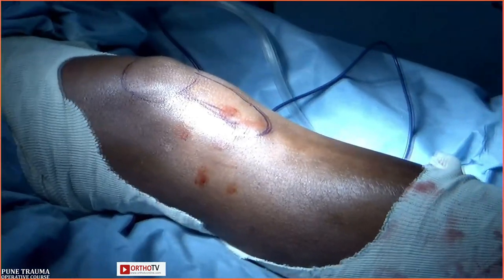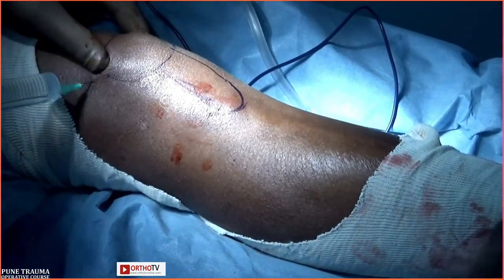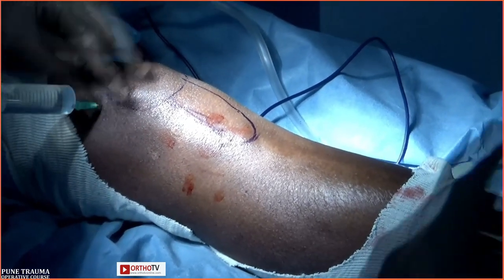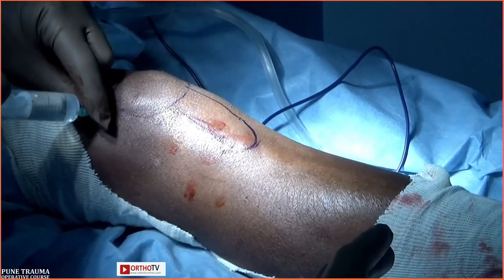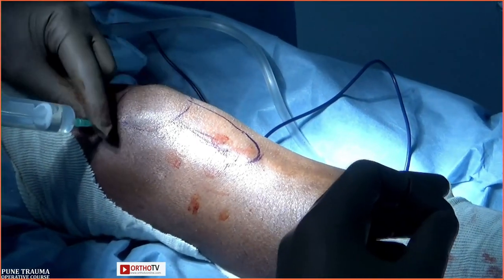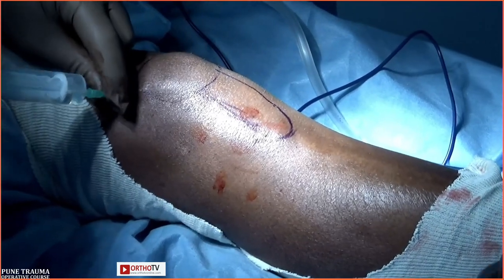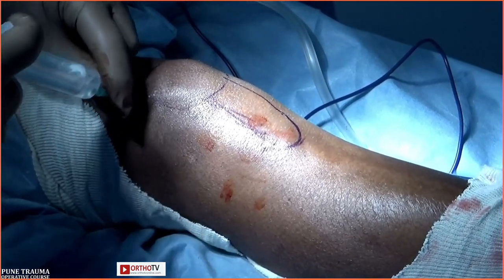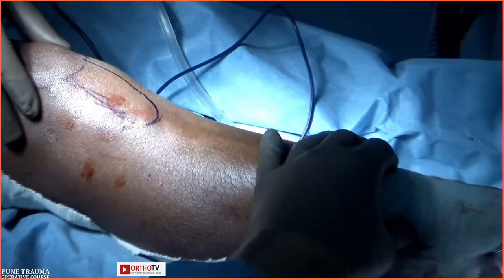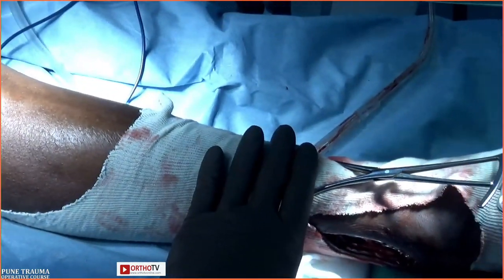Because I thought now Chetan has done a beautiful surgery for the fibular fixation. Because it is a spiral oblique fracture of the fibula and we don't want any malalignment of the fibula. And therefore we have chosen first for the fixation of the fibula. Now I have reduced the fracture by traction, manipulation, and just to hold it here by a clamp assisted reduction.